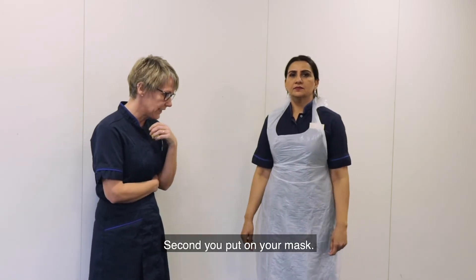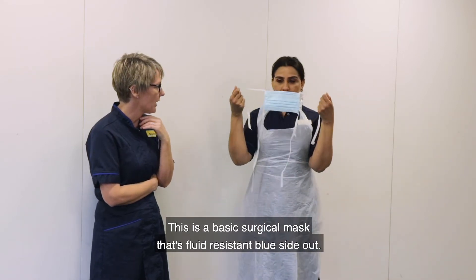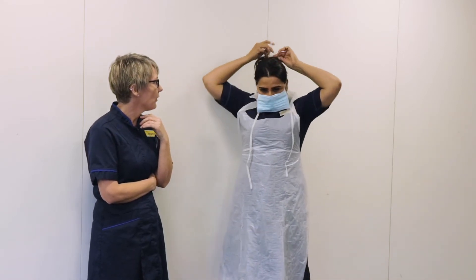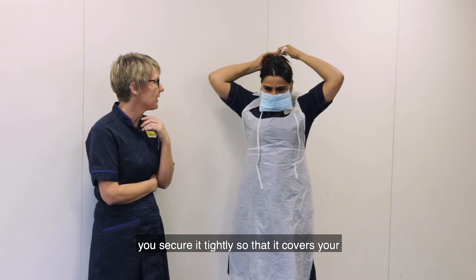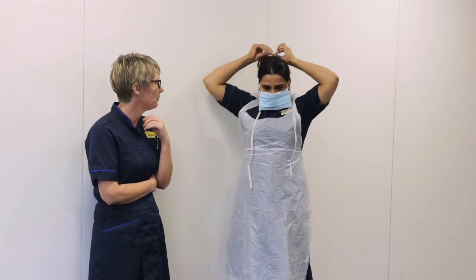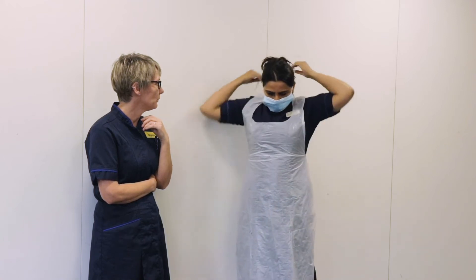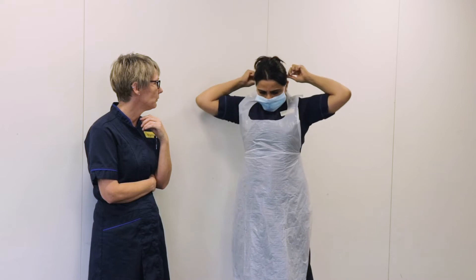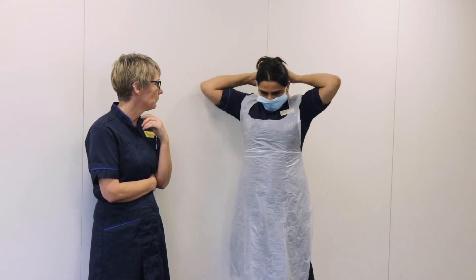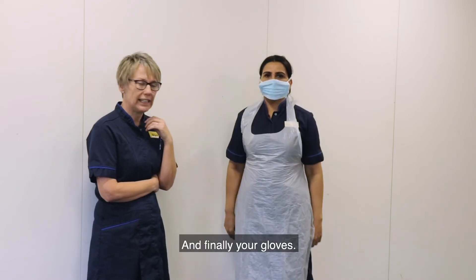Second, you put on your mask. This is a basic surgical mask that's fluid resistant — blue side out. Please make sure that you secure it tightly so that it covers your mouth and nose fully and offers you full protection. And finally, your gloves.